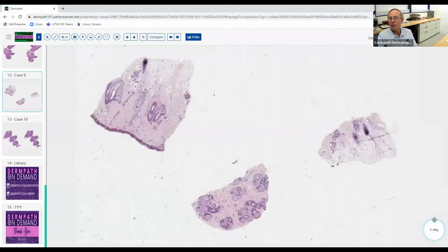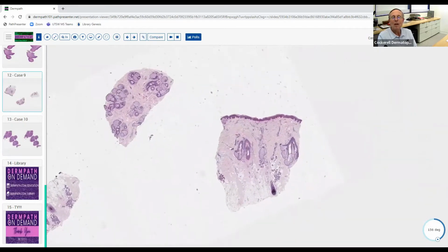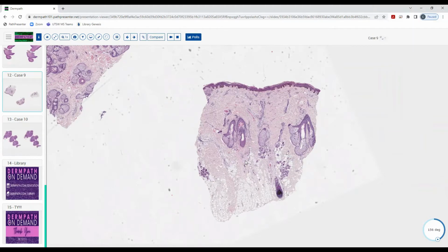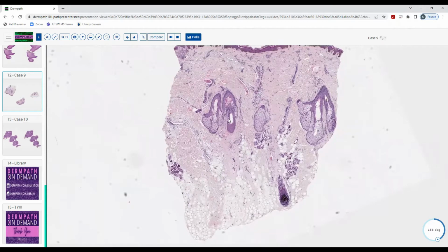All right, shift gears here and look at this. Now what's going on? This looks like we have a punch biopsy. It looks like it's from the scalp, lots of hair follicles and some sebaceous glands. There looks like there's one hair follicle deep, but there doesn't seem to be that many. Trying to see if they're scarred or if there's any type of inflammation around them.